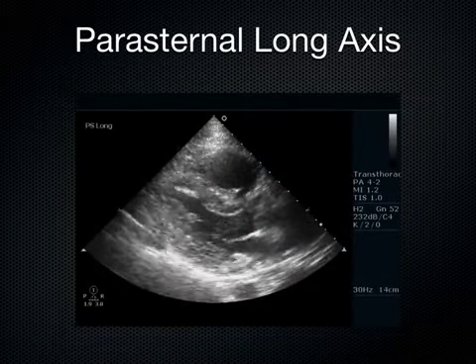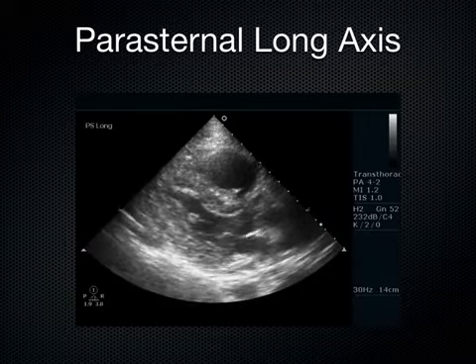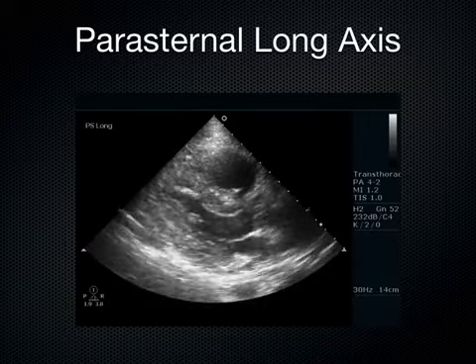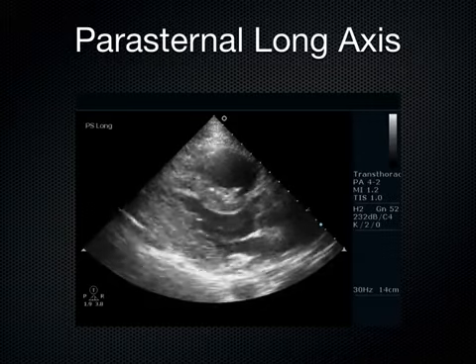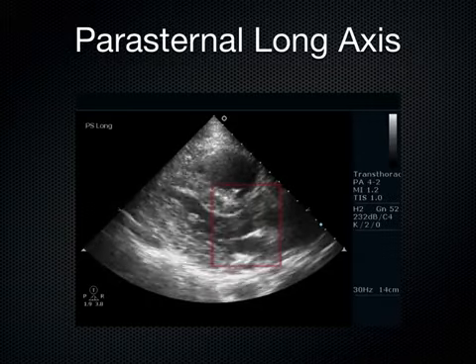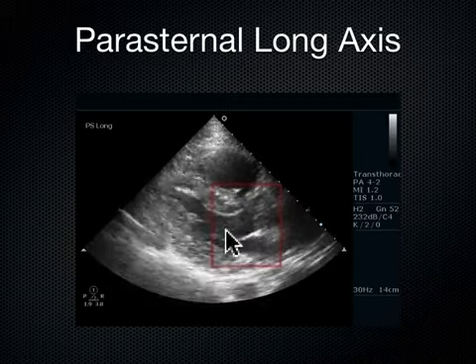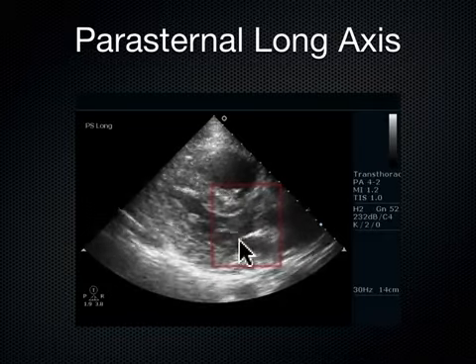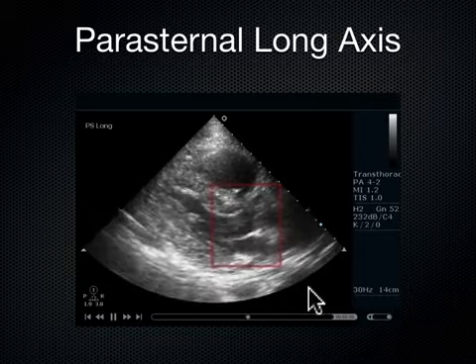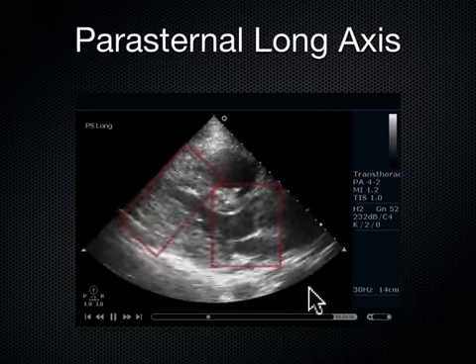What do you think about this heart right here? First question that comes to my mind, I look at this heart, I look down at the patient, and I'm like, are they dead? Does this patient have a pulse? Because this heart is really not looking good, right? So first of all, we've got that mitral valve. The mitral valve is just sort of camping out right here, not doing hardly anything at all. It's almost just fluttering along there, not really making any decent headway towards the septum.